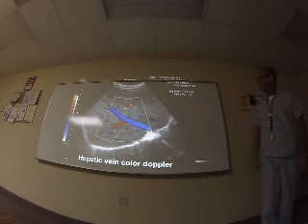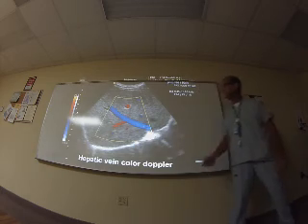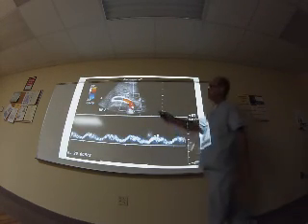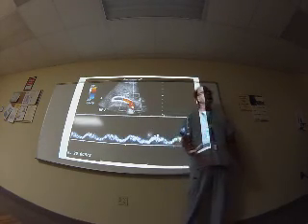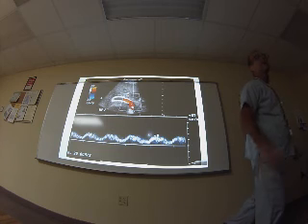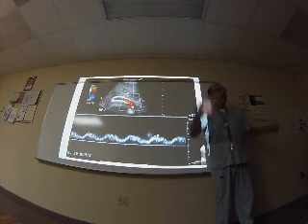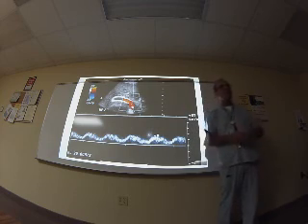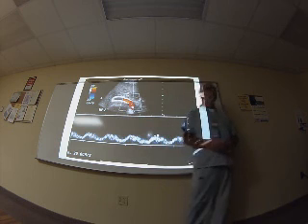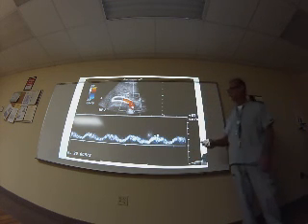And you can see here, this is the hepatic vein color Doppler. This is not the portal, this is the hepatic vein. Okay, here you have a spectral Doppler of the portal vein. Look at this, it is curious in the portal vein. It's a vein and the walls are echogenic. This is the difference of the portal vein. It gives blood and also has characteristics of arteries. Remember, arteries have echogenic walls, but veins do not. And that is why the portal vein is the contrary of other veins.